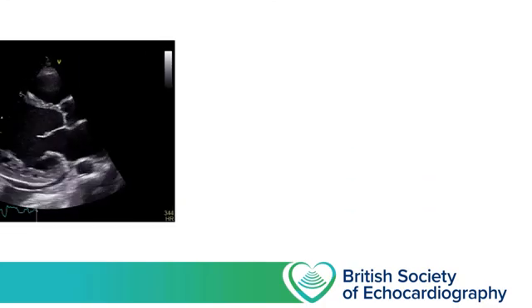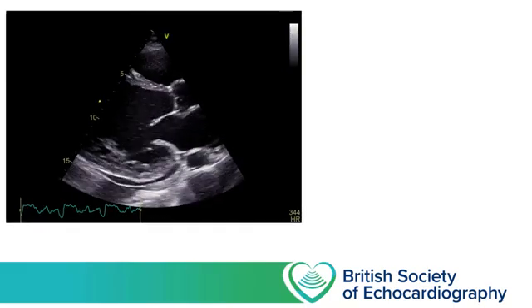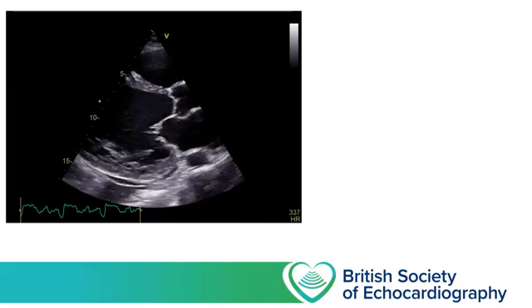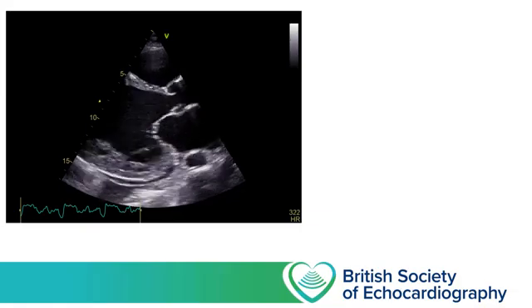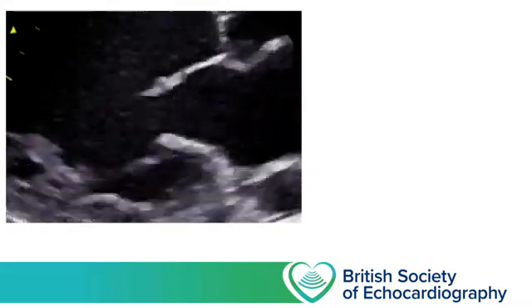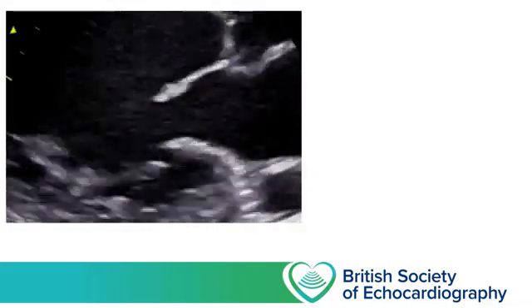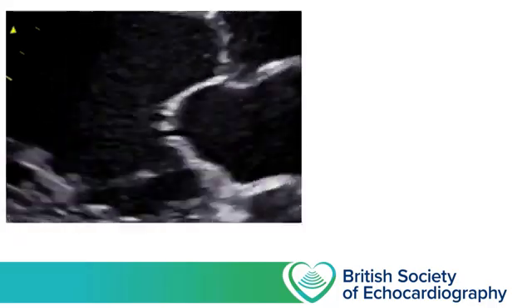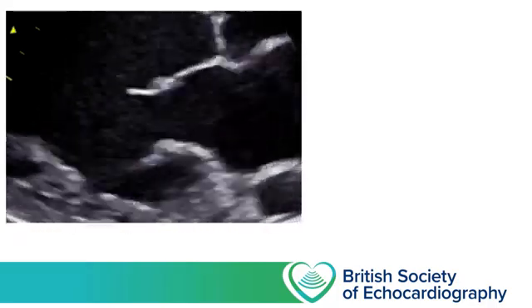So this next case is from a female middle-aged patient who presented with several months of dyspnea. And if we start with the 2D parasternal long axis view, we're immediately struck by the dilated left ventricle, which exhibits poor contractility during systole. If we focus on the mitral valve, we can see that it doesn't open terribly well during diastole. It's not flung open. However, the leaflets themselves aren't terribly thickened or calcified, and the most likely cause of this here is just low flow across the mitral valve.